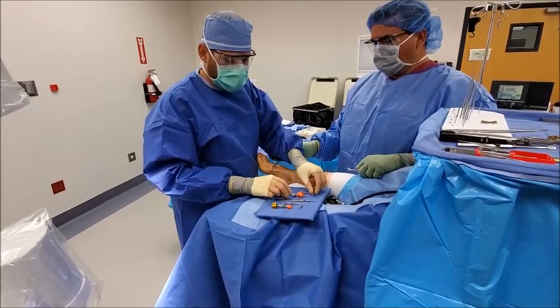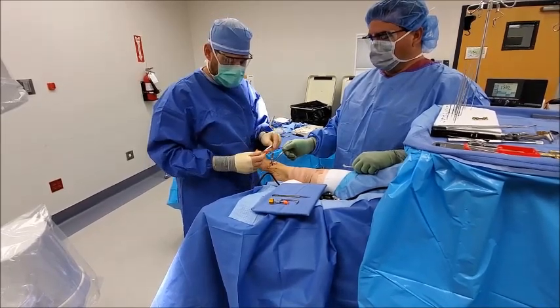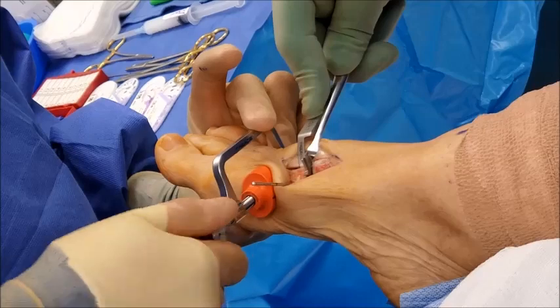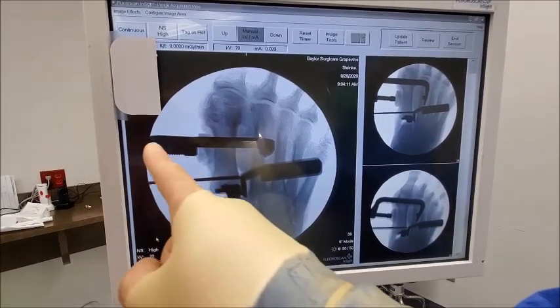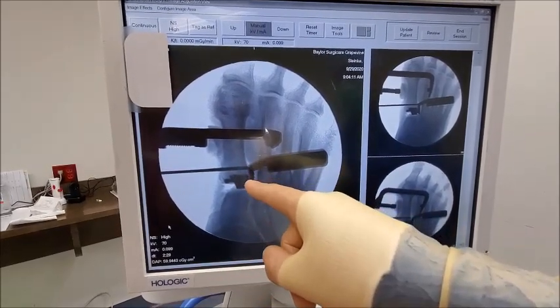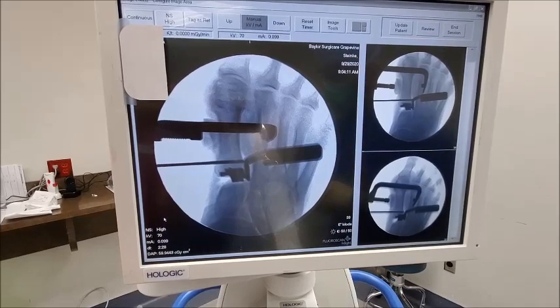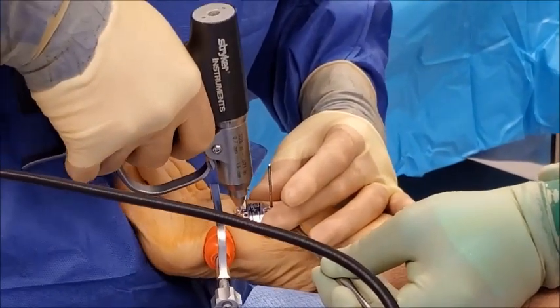What the company Therese has come up with is the minimal incision reduction clamp, which has a clamp that goes on the outside of the skin. This reduces the incision length and the amount of dissection required, so patients should hopefully have less swelling, less pain, and a smaller scar. We apply the reduction clamp between the first and second metatarsals via a small stab incision, reducing them so they're parallel with each other and the sesamoid bones are back in anatomic position, equally distributing pressure when this patient walks.